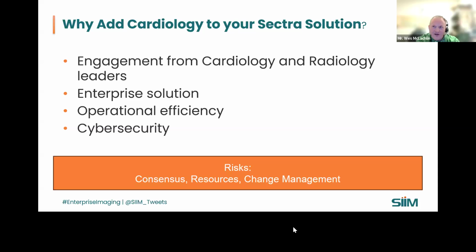Yeah, thanks. So we started down our PACS journey. We had a legacy PACS environment that supported solely our radiology environment. And when the decision came, as an organization, to add cardiology to the fold, we were able to leverage that single archive, the same archive, to support cardiology, but with applications focused more on their requirements. That was done in, I think, 2006. Cardiology came on board in 2010.